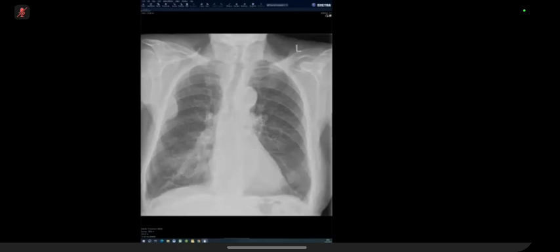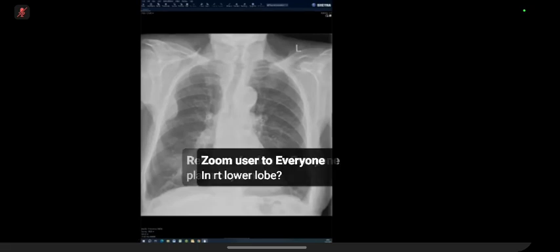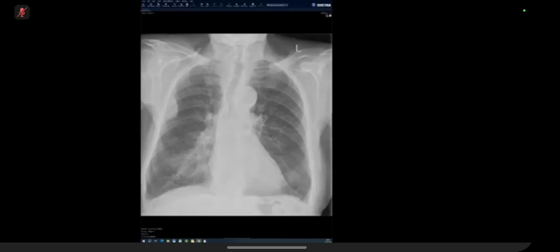Miliary TB is, like you said, hematogenous spread. When somebody is immunocompromised, they have a bit of everything going on, and this patient was actually reacting to a drug as well. So this was a mixed diagnosis of hypersensitivity with superadded atypical infection. But in miliary TB, you should not have tree and bud. In endobronchial spread of TB, you have tree and bud and all these nodules. When you have centrilobular nodules, that implies that there's something inside the airways.